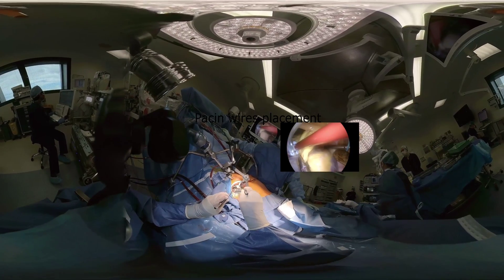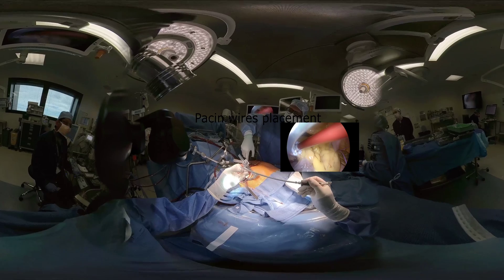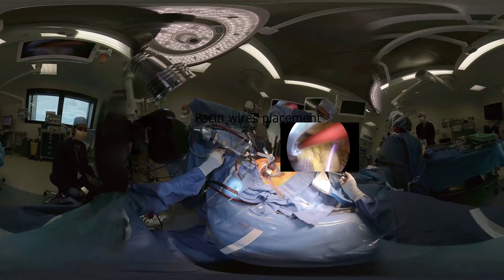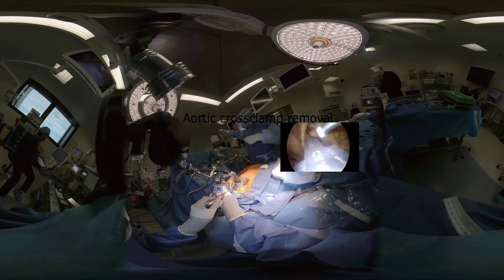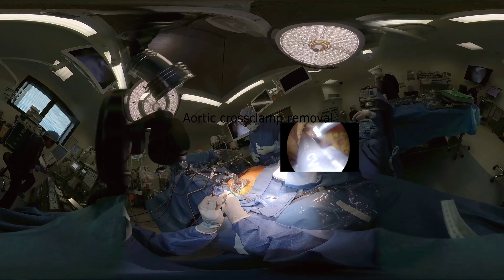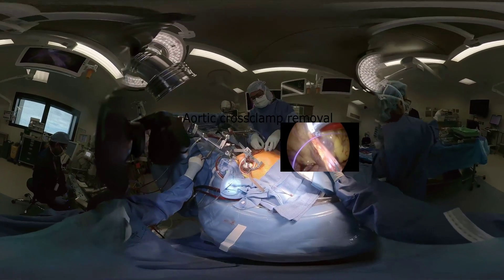Ventricular pacing wires are positioned before removing the cross clamp, as this is easier to do before the heart starts beating again. They are easily exteriorized through the parasternal port. The cross clamp is removed after the airing maneuvers, but the aortic root vent is kept in for as long as possible to complete the airing, similarly to an open procedure.